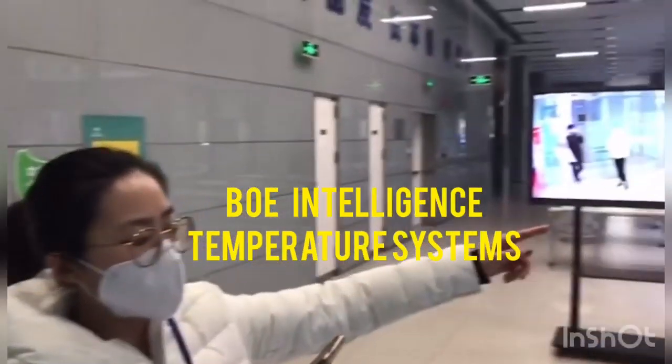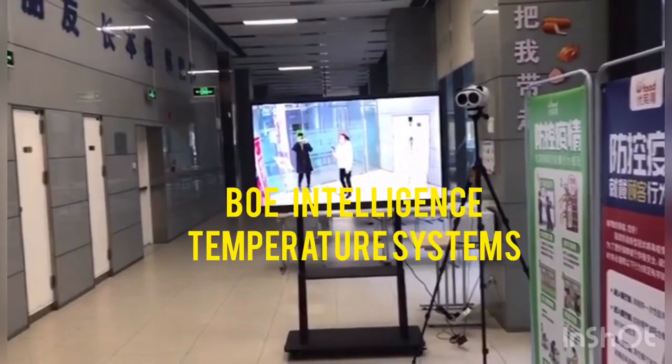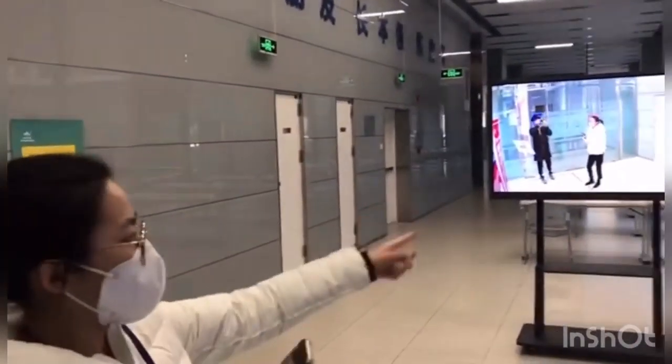Hello, this is our BOE intelligent temperature warning system. You can see it's composed of three parts.